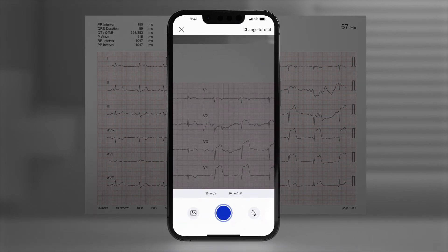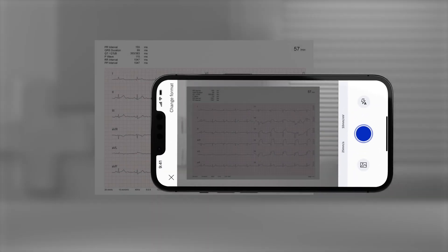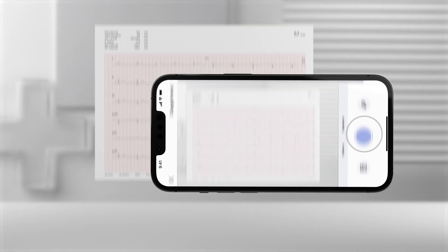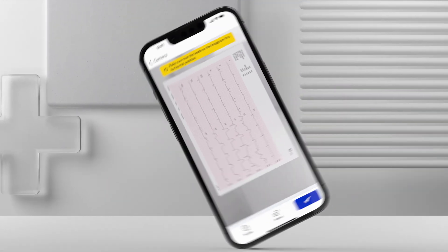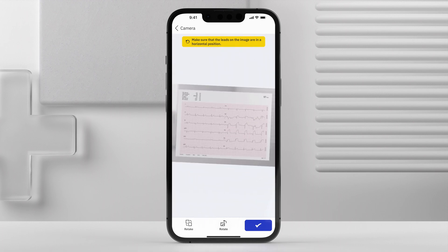Now it's time to take a photo of your ECG. Please ensure you have decent lighting conditions or turn on the flashlight. Make sure that the leads are in a horizontal position. Use the Rotate button at the bottom of the screen to correctly rotate the image.